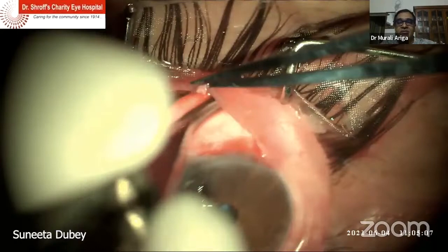I usually place it after the flap is made and generally try to go a little more posterior, and at the same time on either side of the flap, rather than coming close to the limbus. The mitomycin should be placed as far posterior as possible, and it should be evenly distributed, which is why in certain patients I also do the injectable mitomycin.